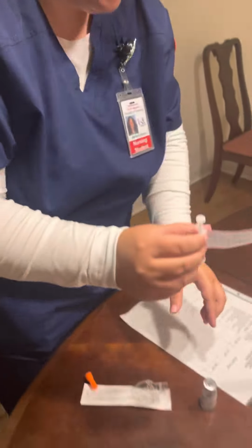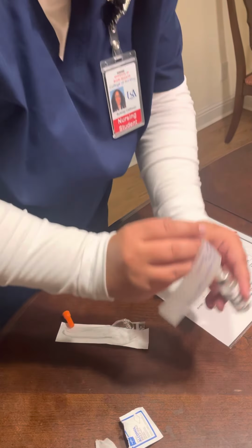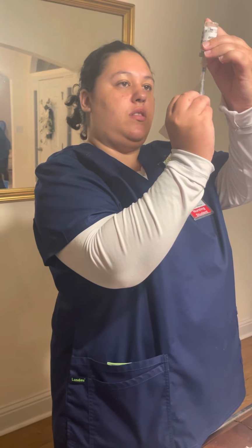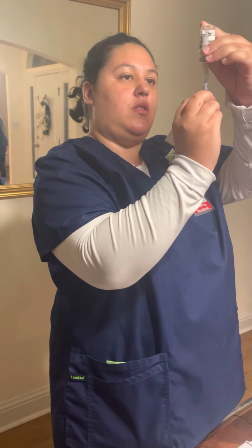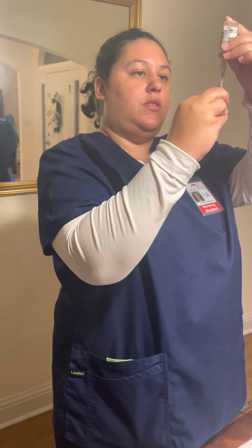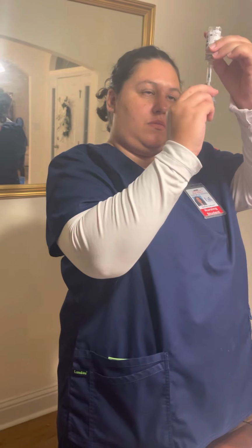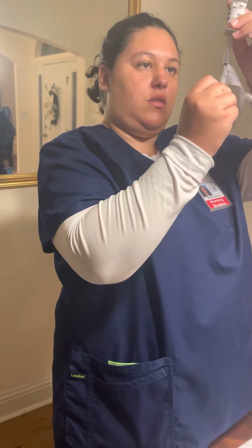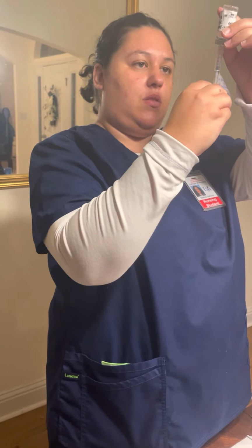All right. Put it in my palm, put it in the 10 units, flip it over, and bump out whatever I need. The bubbles. All right, I'm gonna a little bit more than that.